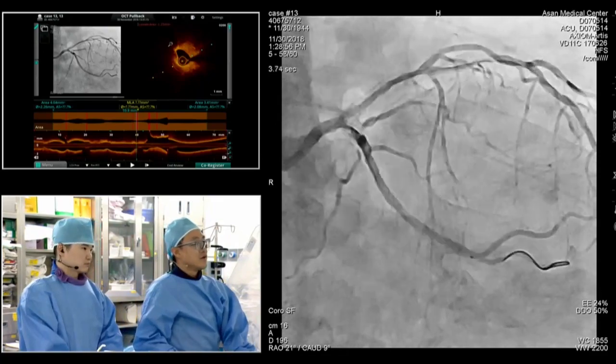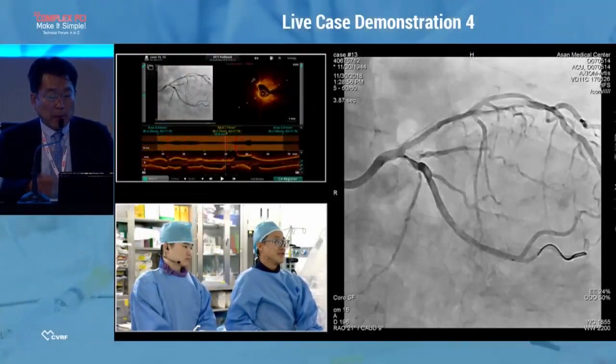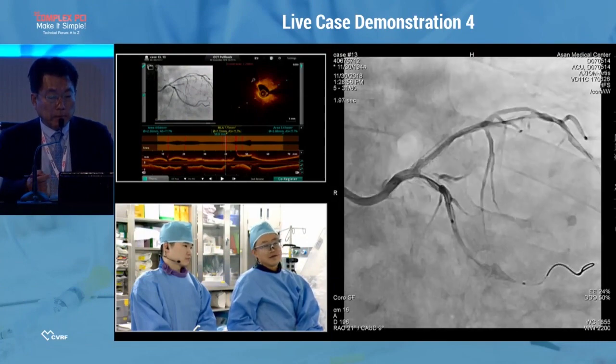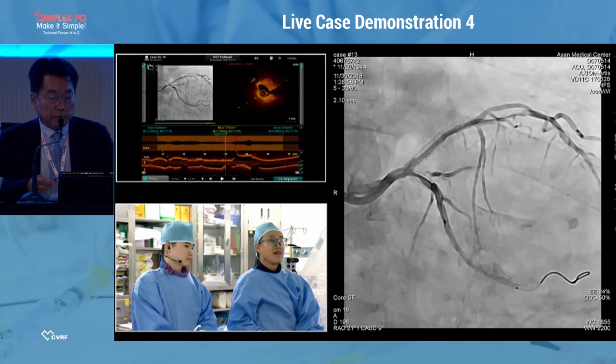Circumflex FFR is 0.9? Yes. All right, so it doesn't make sense. Yeah, so what would you do there?